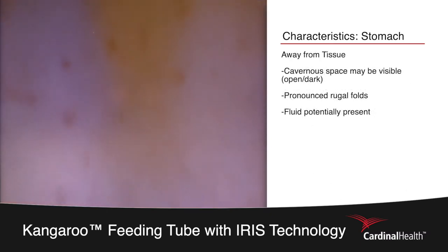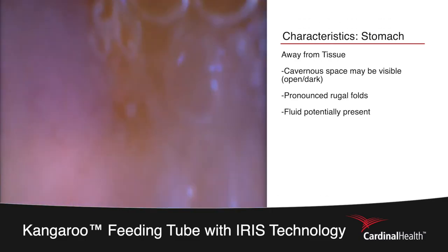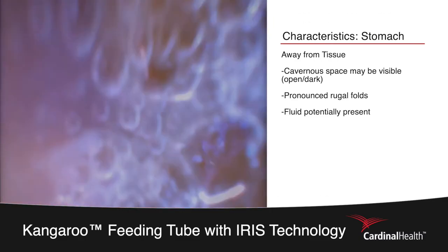In order to visualize the rugal folds of the stomach you can add air utilizing the insufflation device, or pull the feeding tube away from the lining of the stomach.